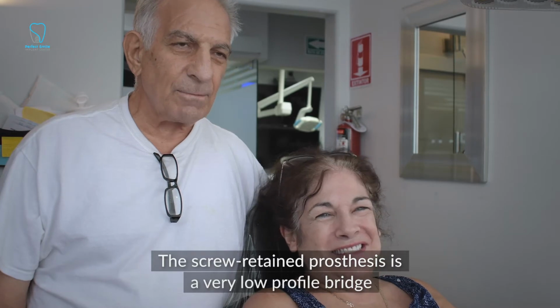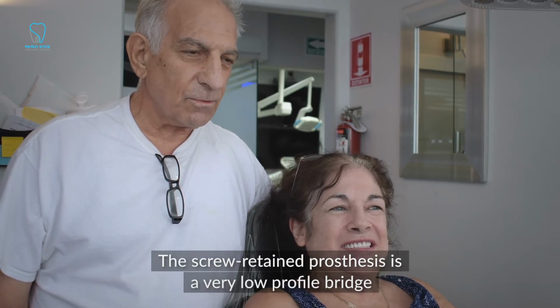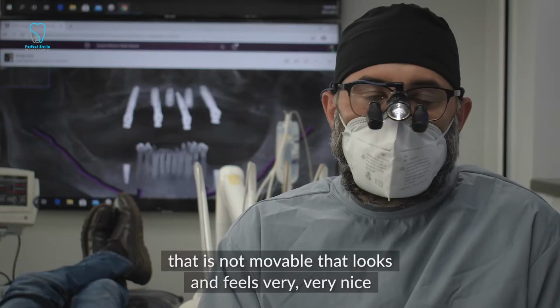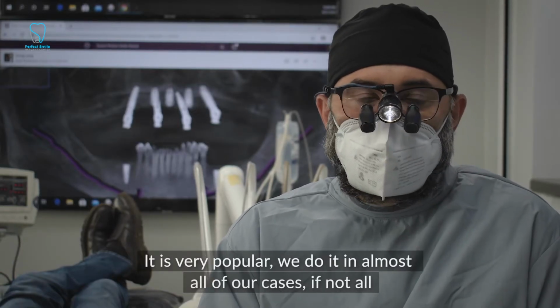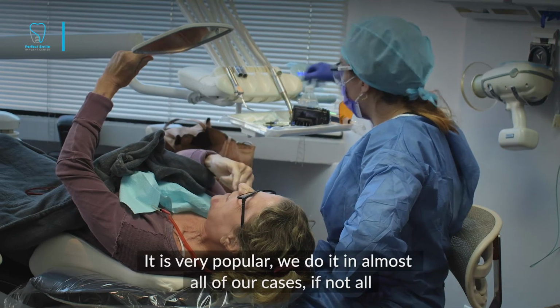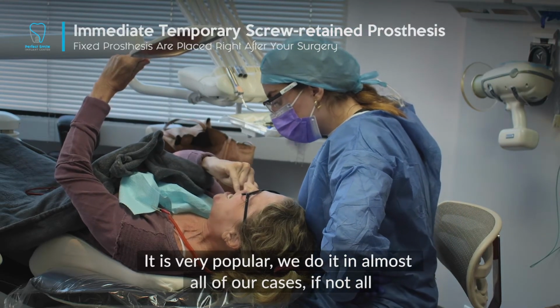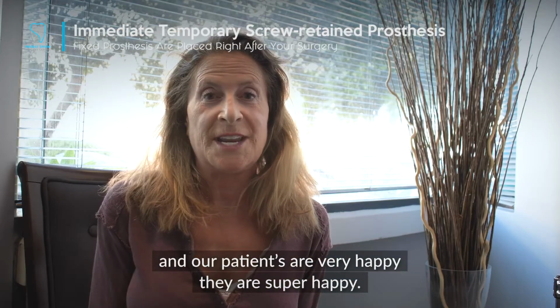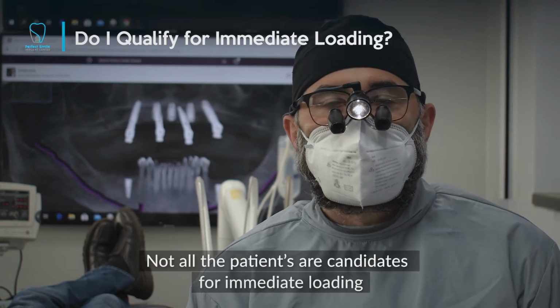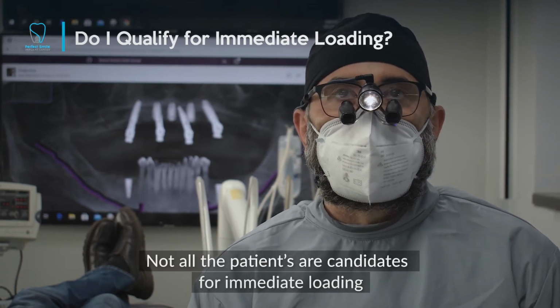And the screw retained prosthesis is a very low profile bridge that is not movable, and looks and feels very, very nice. So it's very popular. We do that with almost all of our cases, if not all, and our patients are very happy. They're super happy. Not all patients are candidates for immediate loading.